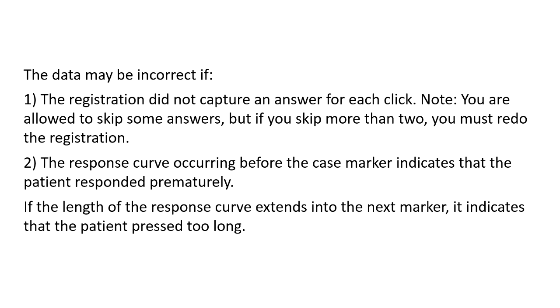2. A response curve occurring before the stimulus marker indicates that the patient responded prematurely. If the length of the response curve extends into the next marker, it indicates that the patient pressed too long.